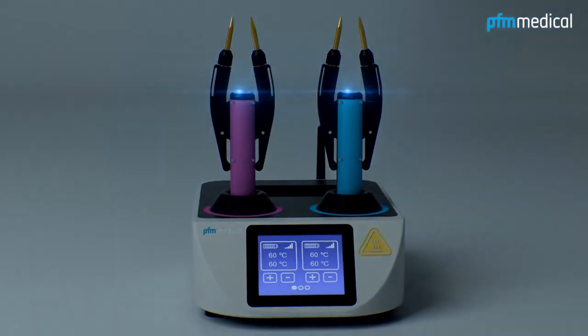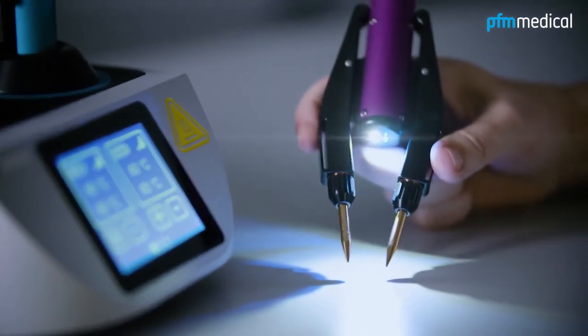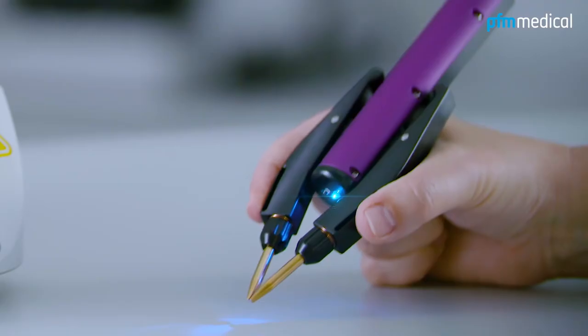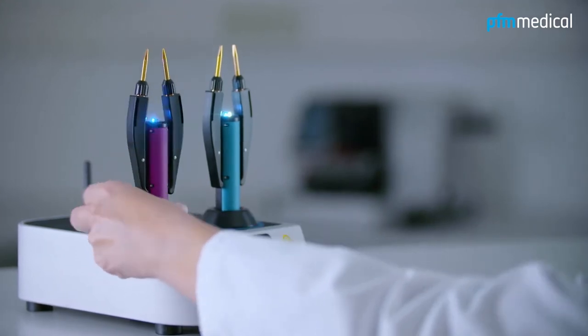Well thought out in every detail, the integrated white light illuminates the work area and especially facilitates the work with smaller tissue samples. An additional flashing indicates a low charge status, providing sufficient time to change the forceps.